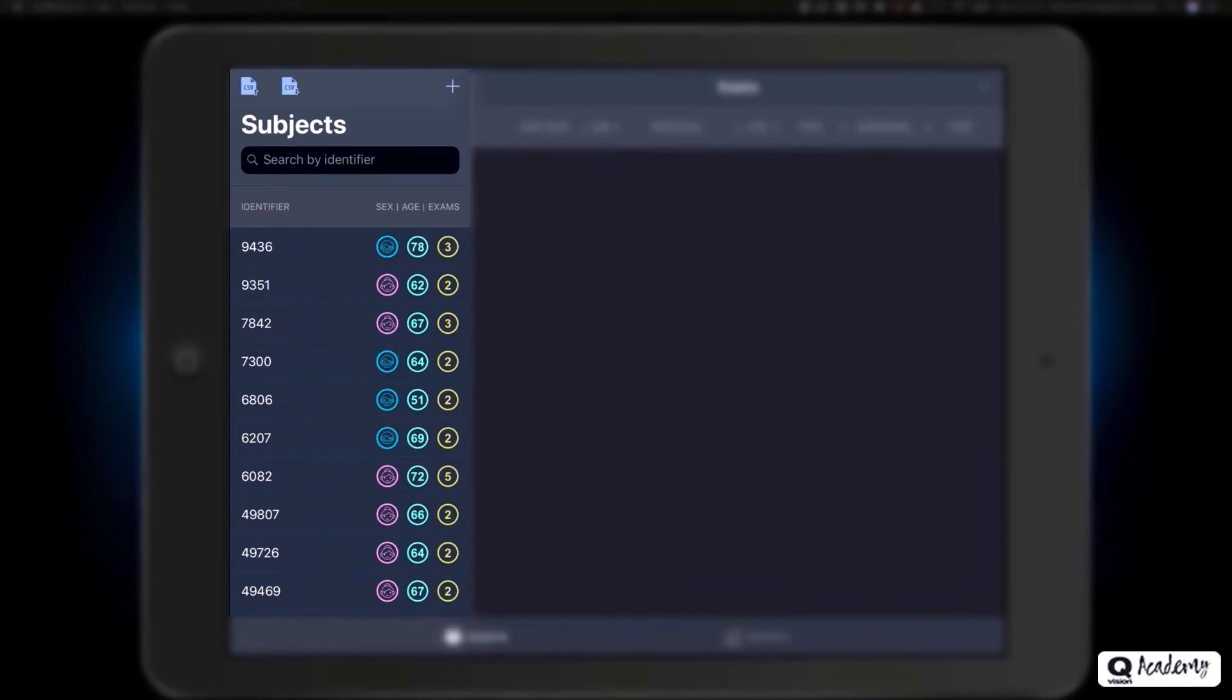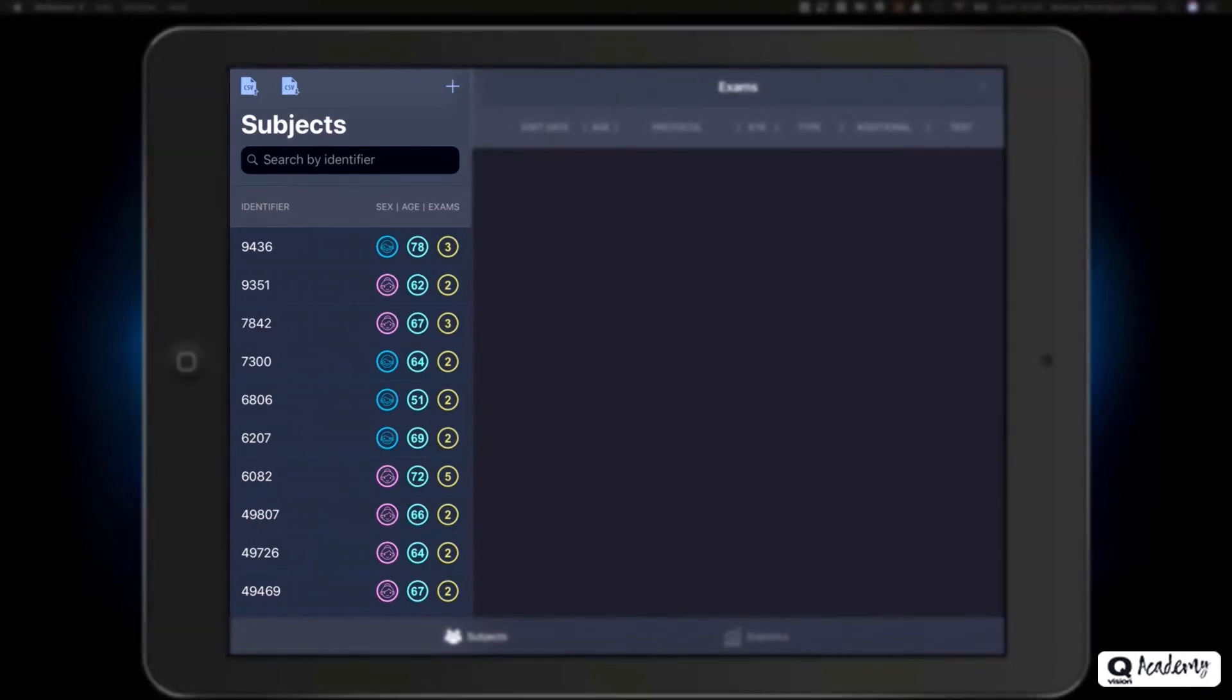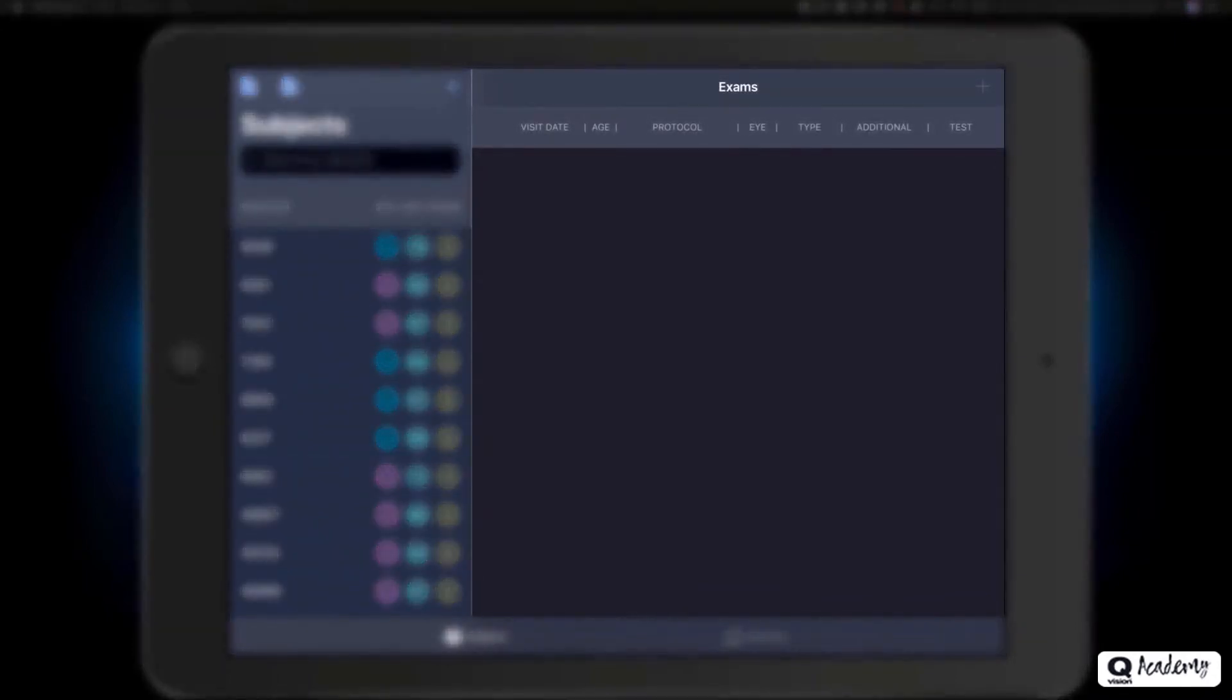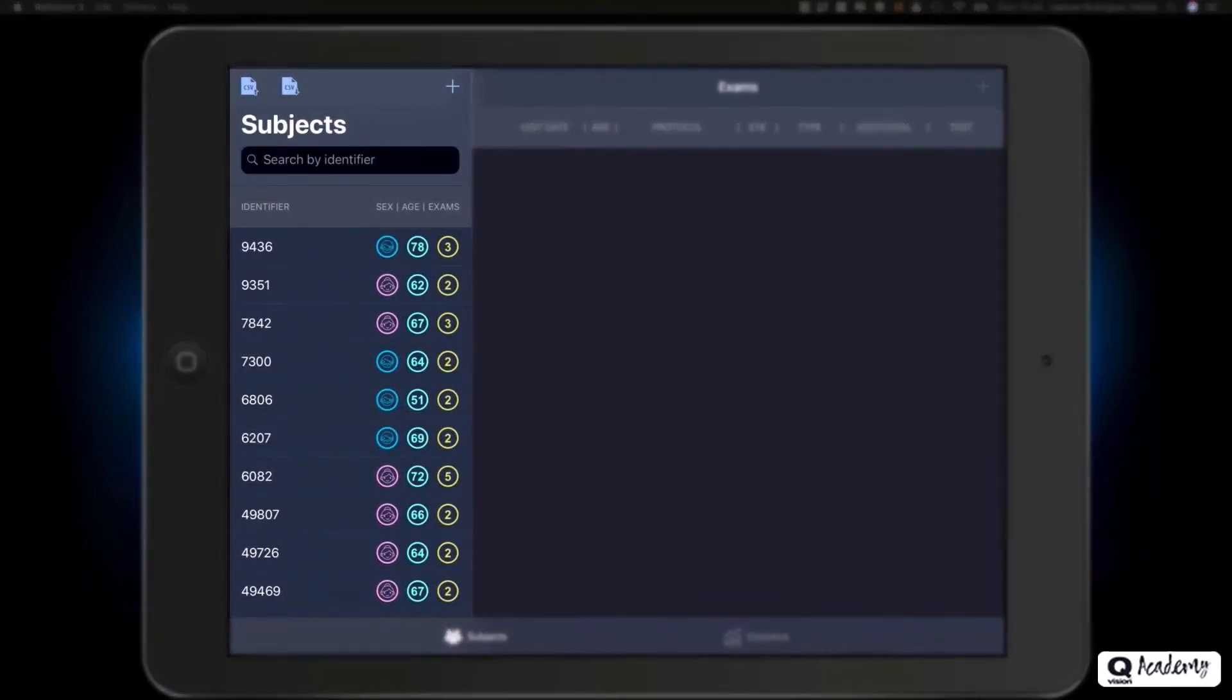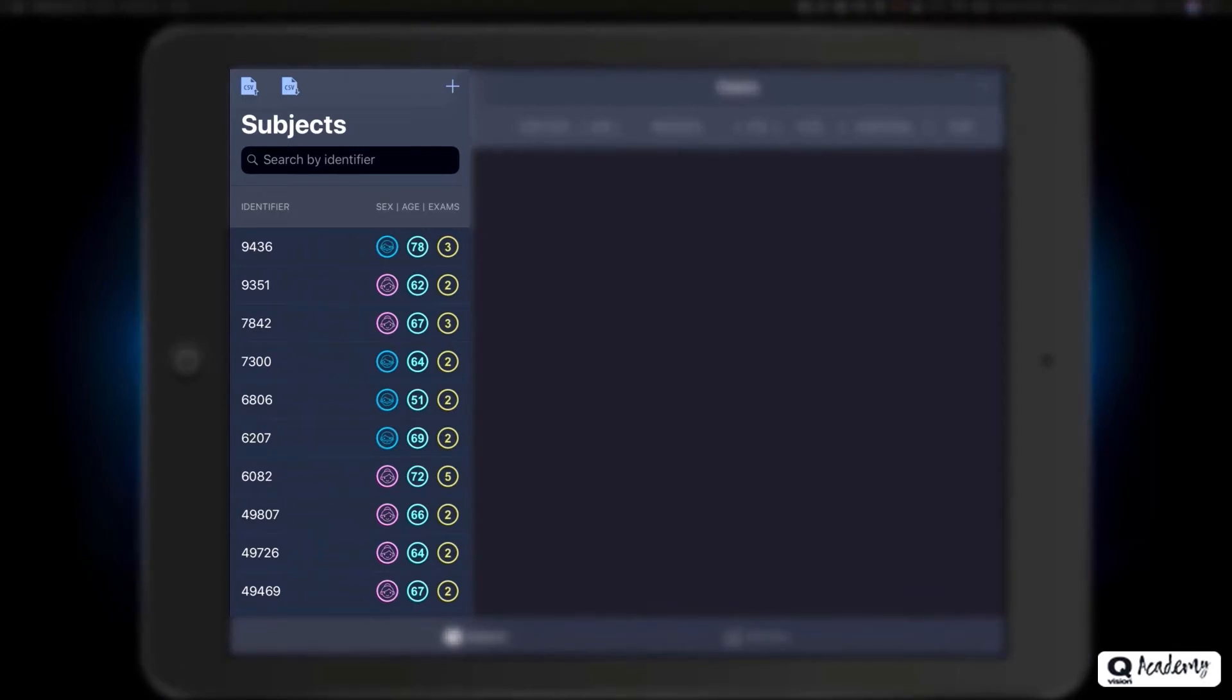We are on the subjects screen, with two main modules: subject and exams. In the subjects module, you will be able to store each of your research subjects via a pseudo-identifier.